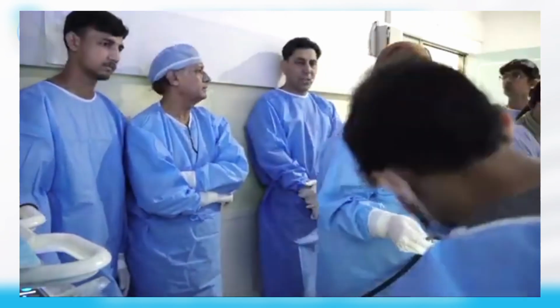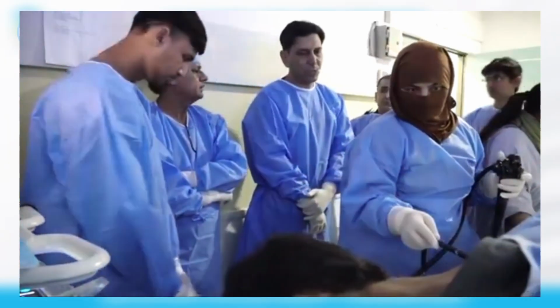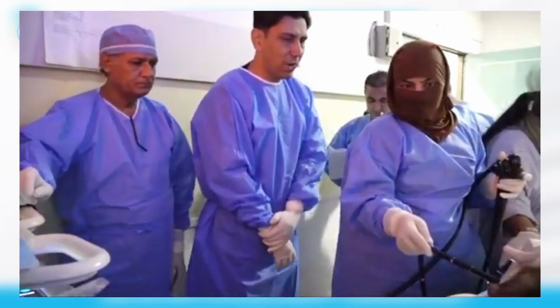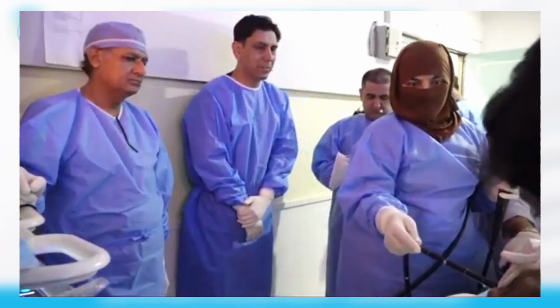So Seher is going to start the procedure. Seher, just for the benefit of the delegates in the room, what we would like you to do is talk us through every step along the way, please.